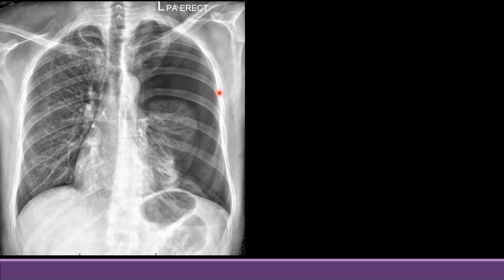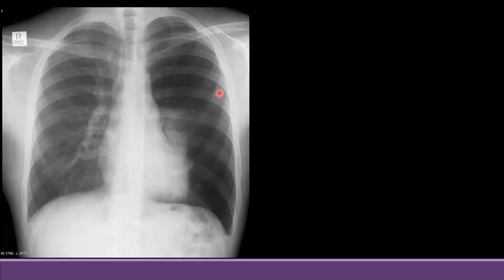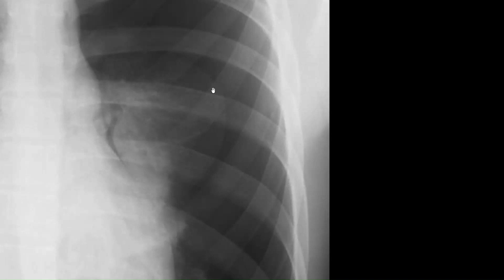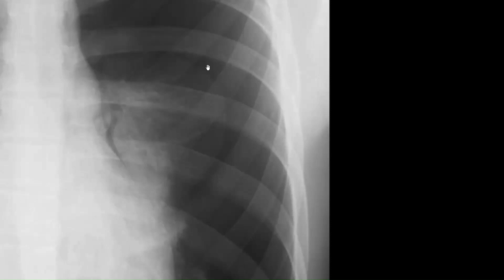Here is another pneumothorax X-ray. On the left side, there are no vascular markings across that entire area, while you can clearly see normal vascular markings on the right side. You can again see the line of the collapsed lung. This type of collapse is different from lobar collapse studied earlier — in pneumothorax, there is air pushing the lung away from the chest wall, whereas lobar collapse is usually due to an endobronchial lesion.